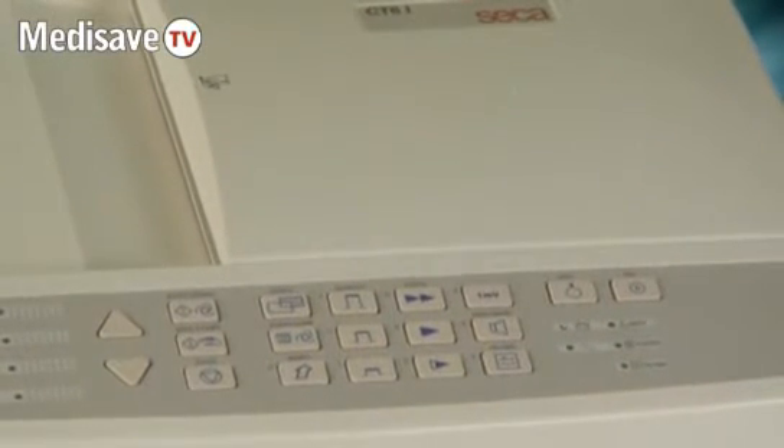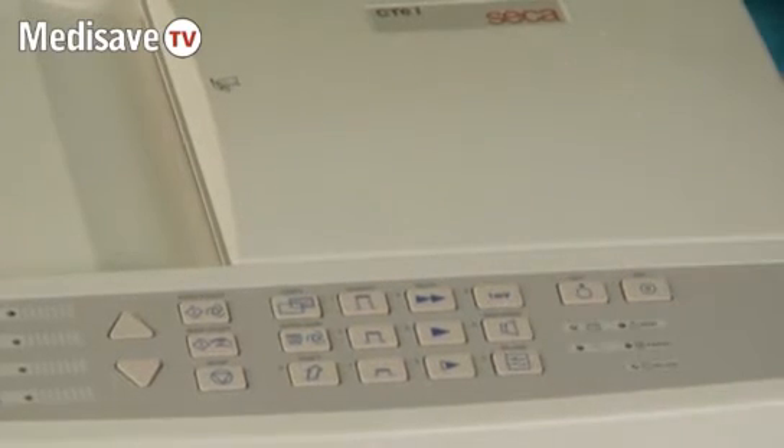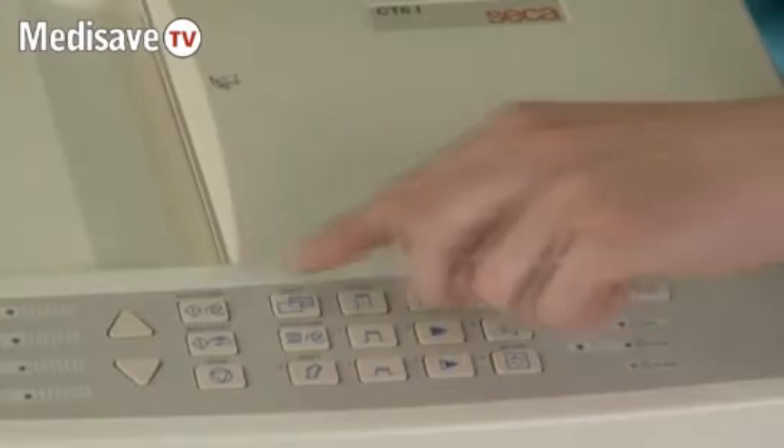If you feel that you may need to use the filter, simply press the filter key. And when you are happy that the patient is lying still, press the auto start key.